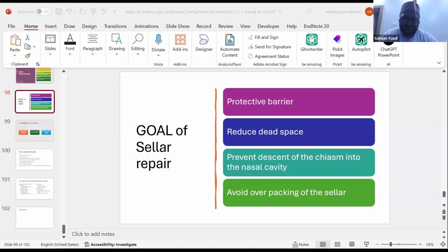By the time you pay attention to the middle turbinate, it can be a guide for you. That is why, as neurosurgeons, we don't do a turbinectomy routinely. The turbinates serve as a map. For starters, I will advise that you try to master the binostril approach because it gives you wider manipulation for your endoscope. Most of us may not have the luxury of having an endoscope holder, but if you have one, it helps. Otherwise, you need a good assistant. Sometimes the procedure can be very nauseating if your assistant is not well tutored.